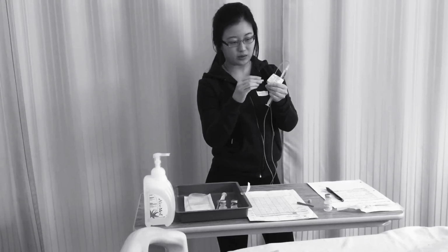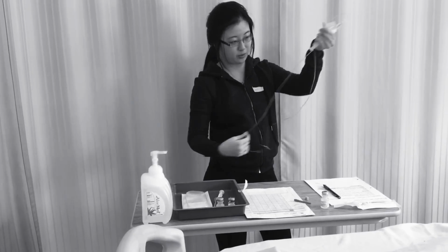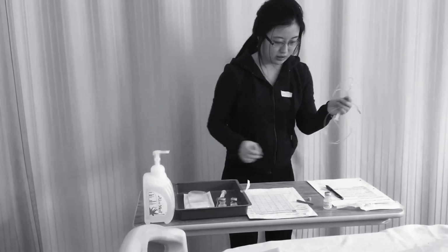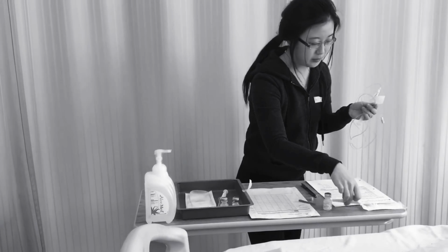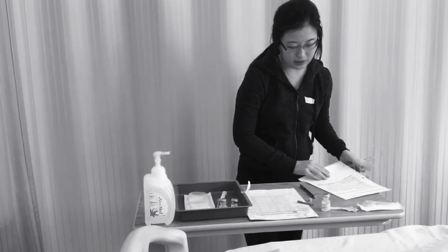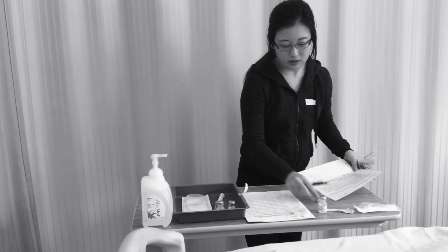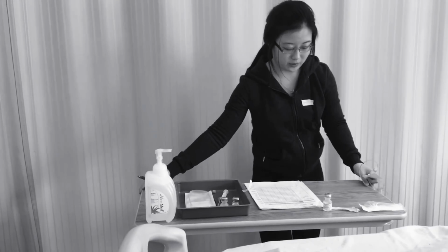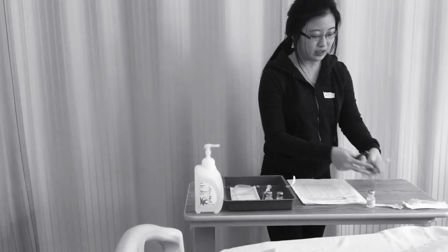So I see that there's liquid coming out the other end, so I can cap it again. There's no bubbles. Okay. I'm going to go to the bedside now with my MAR. So I'm just going to walk in here. So I go in, safety check.